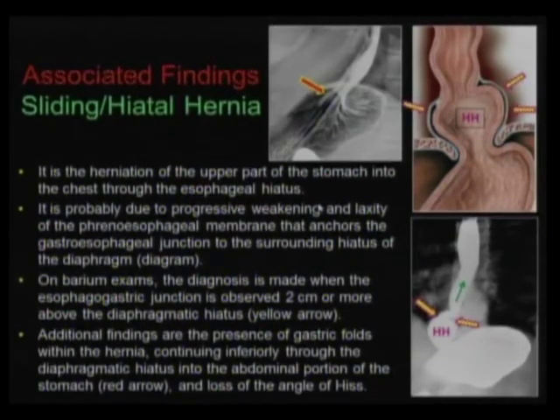One of the contributions of radiology is that when there is a diaphragmatic hernia, we can easily differentiate between a sliding herniation or a paraesophageal herniation, something that is important in order to decide the urgency of the surgical procedure.